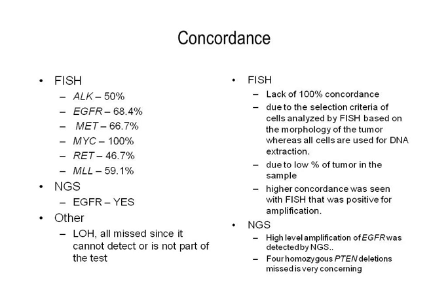We missed 4 homozygous PTEN deletions. And our assay, when we validated, was not meant to pick up these deletions. And now we have additional bioinformatic tools which we are validating, which can hopefully help us. But loss of heterozygosity, all of them were not detected by our assay.